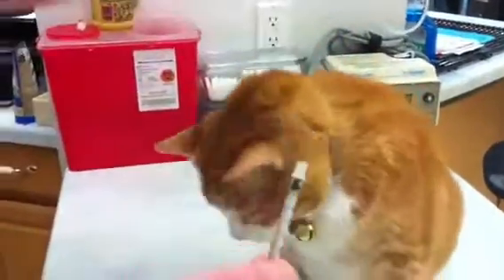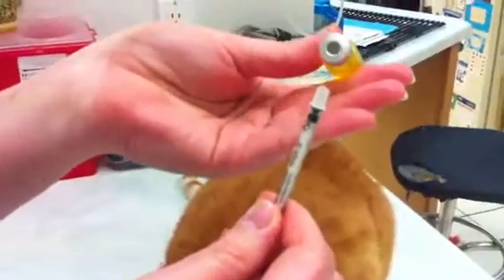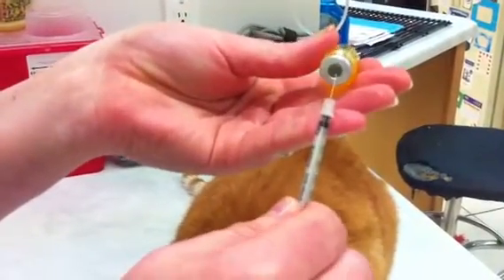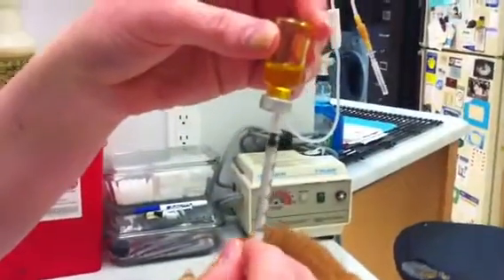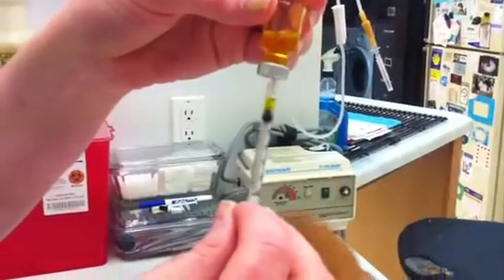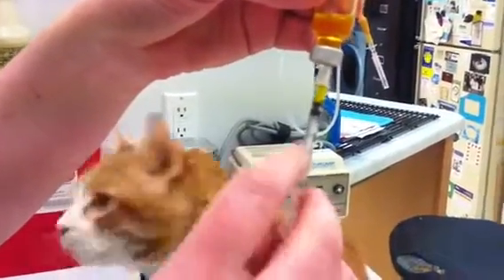To draw up insulin, you're going to insert the needle into the rubber stopper of the vial. Hold it vertical to avoid air bubbles. Pull back to about five units.